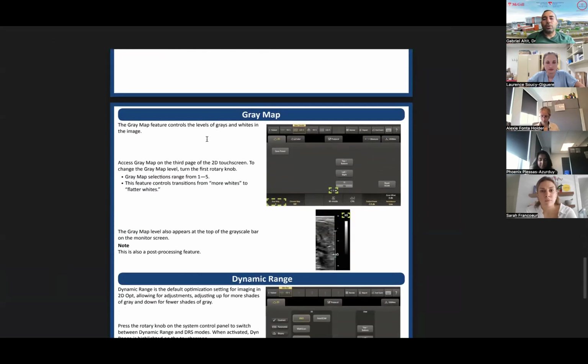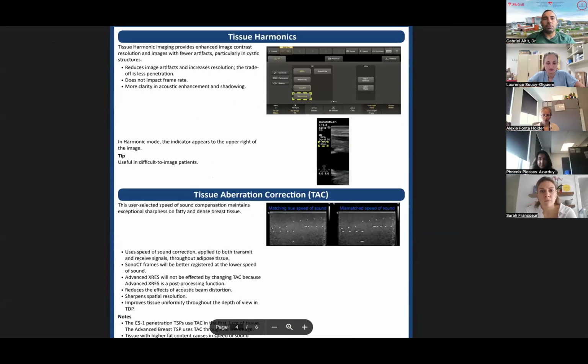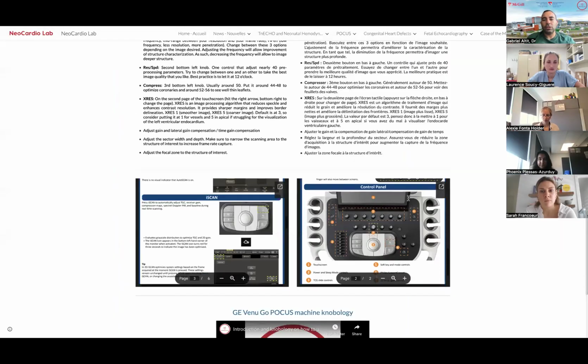Okay. We're not going to go into tissue harmonics, dynamic range, all these things you can read. This is a bit more advanced application.